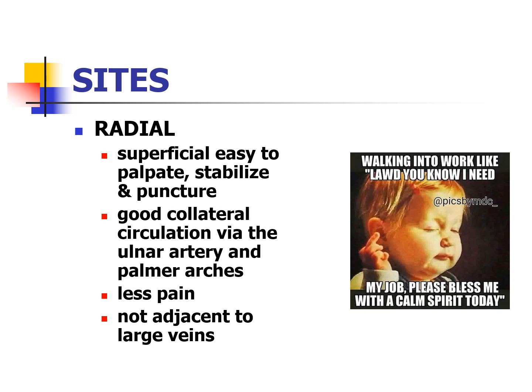So it's very stable. You have sort of a bunch of tendons in that area because it's the wrist. So it's not going to move around on you. So unlike a vein that rolls, this one just has a very thick outer layer. Arteries have a very thick outer layer. So if you just go in slowly, you advance your needle slowly, you may actually push the artery out of the way and not even puncture it, even though you have a needle going in there. That's how thick that thing can be.